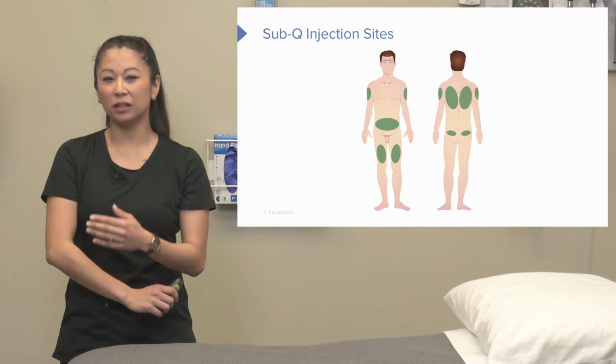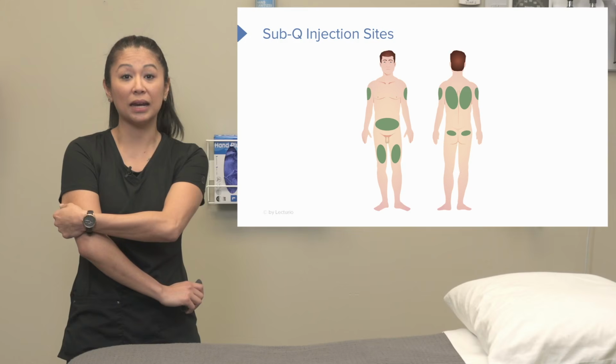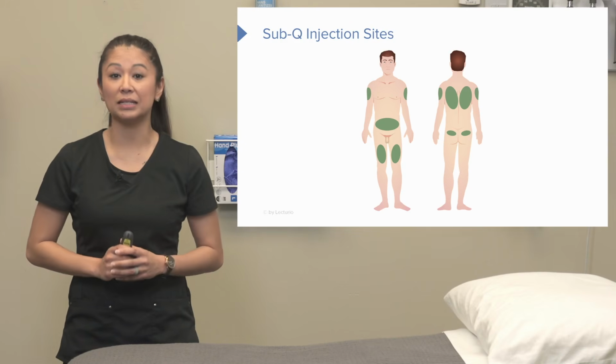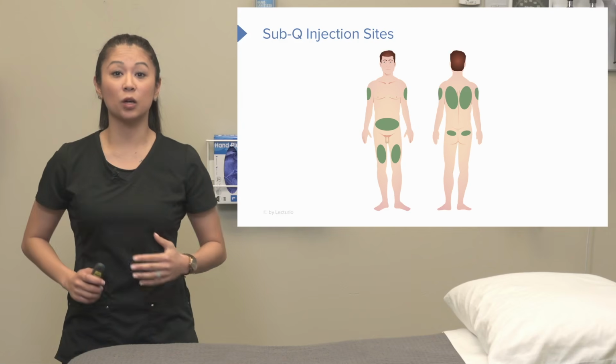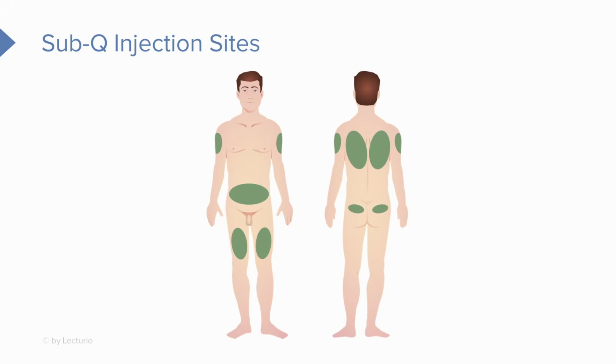The image may be a little confusing here, but make sure you know you're going to go into the subcutaneous, the soft part of the back of the arm, for a subcutaneous injection. What we're going to give here, more than likely, is an insulin injection if the patient prefers. Also, a very common and safe injection site, as you see here, is the abdomen.